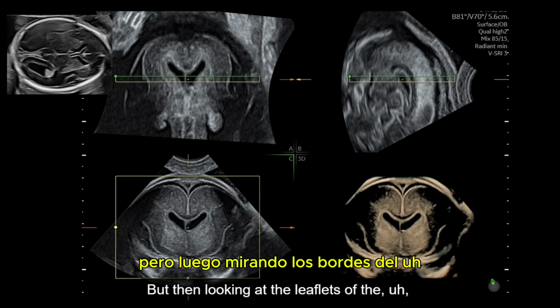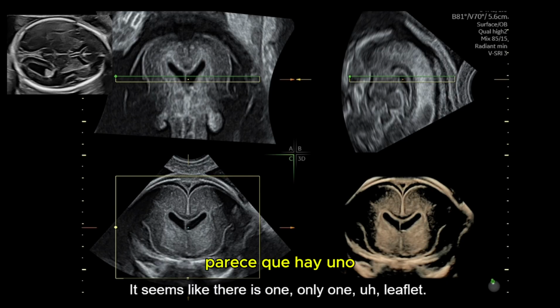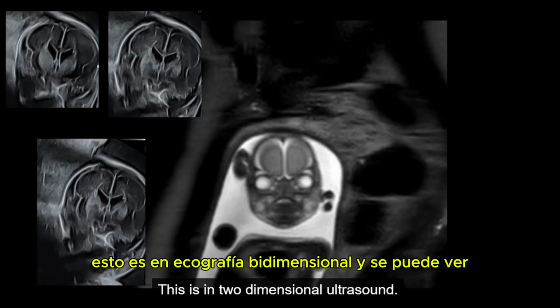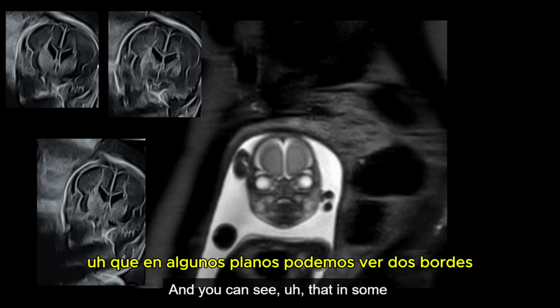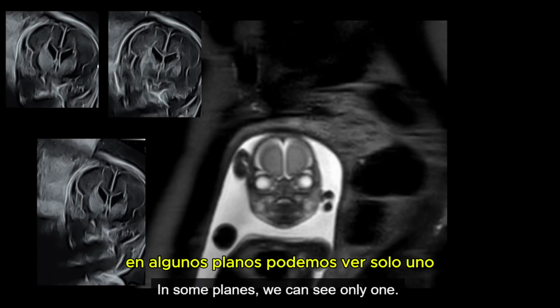But then looking at the leaflets of the septum pellucidum, you can see that there is something very strange. It seems like there is only one leaflet. This is in two-dimensional ultrasound, and you can see that in some planes we can see two leaflets, in some planes we can see only one.